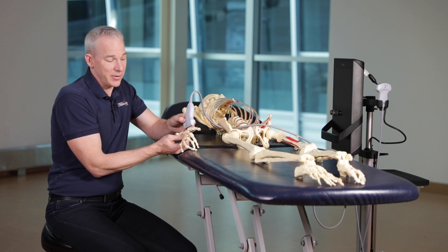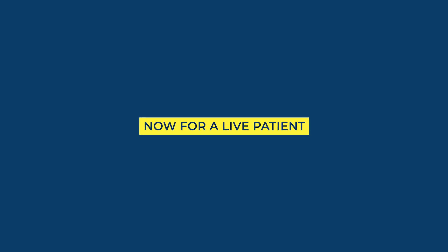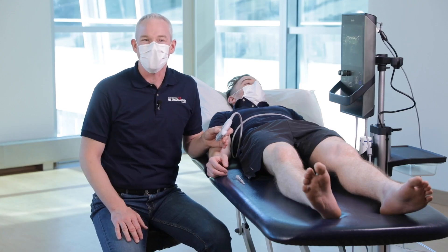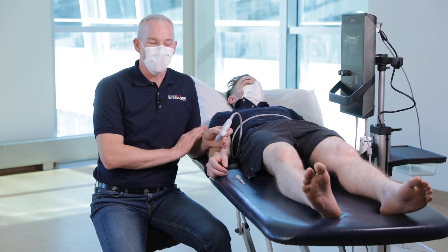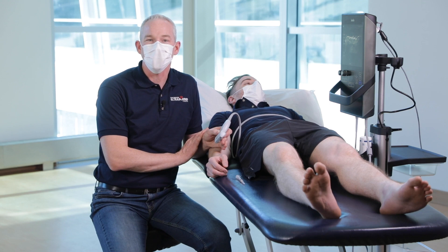So that's how we scan for the CMC joint. Now I'm going to show you how to scan and inject the CMC joint of the thumb. I usually like to have my patient supine; however, some practitioners prefer the patient seated.